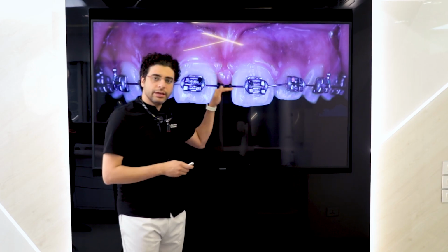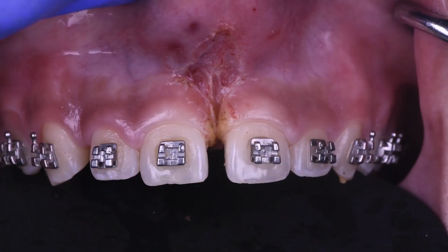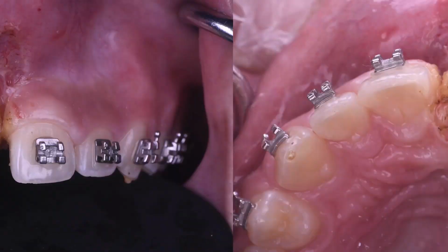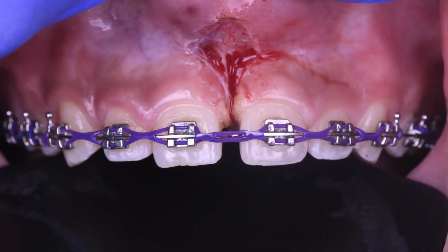The best time to remove the thick labial frenum is after leveling and alignment and before complete closure. So after reaching the rectangular arch wire, it's the best time. Here I removed the thick labial frenum with electrocautery. Deep removal is necessary to remove the soft tissue inside the bone, and on the same day you should put the stainless steel rectangular wire and the power chain from first molar to first molar. Don't forget to remove the frenum 1 mm palatally and put the power chain on the same day.